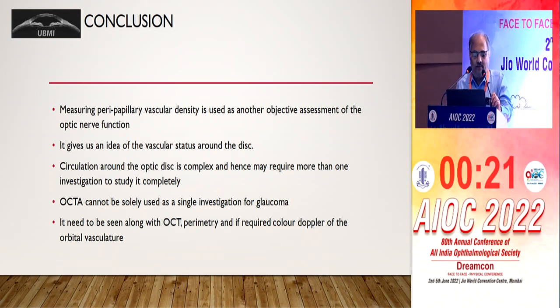Harry started it way back, and he has done a lot of work, which still stands good. But only looking at clinically and OCT and OCT angio may not probably give us the full answer, because there are some vascular causes beyond the optic nerve which clinically cannot be made out. But Doppler is also a test which can be added to it to give us a diagnosis. Whether we can do something for the patient or not, we do not know, but it's an added investigation which can at least point what is going on.